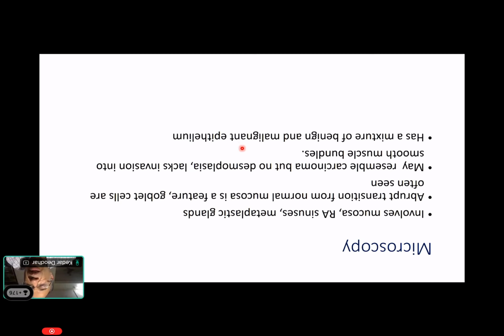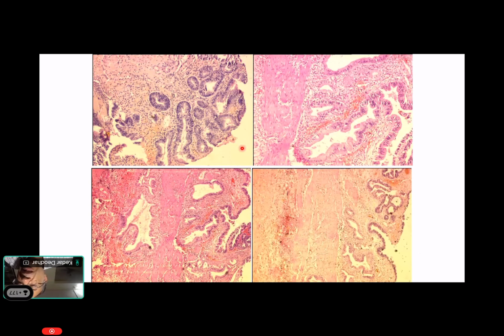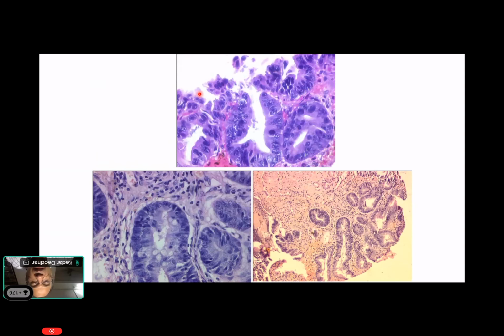So this is an example of a gallbladder. We have actually a high-grade dysplasia. We can see the hyperchromasia. We can see the stratification. On the higher power, we actually see a high-grade dysplasia here in the bottom slide. We have a loss of polarity. We have mitotic figures, and we also have some atypical mitotic figures. But this tells us about presence of high-grade dysplasia.